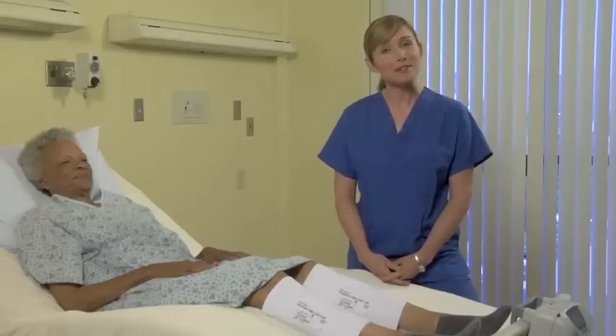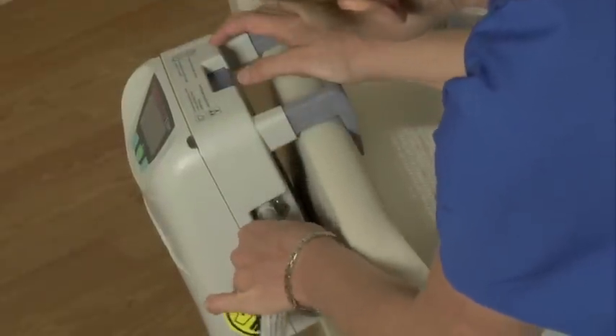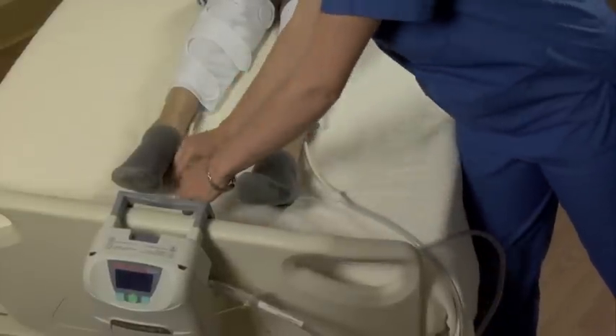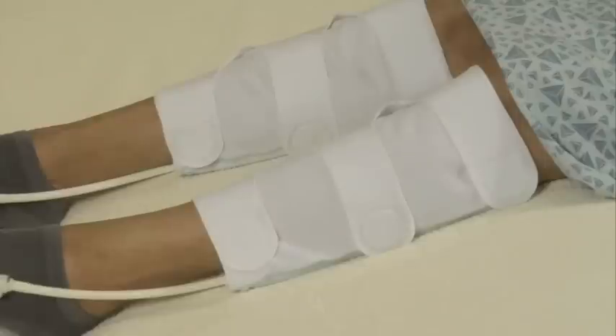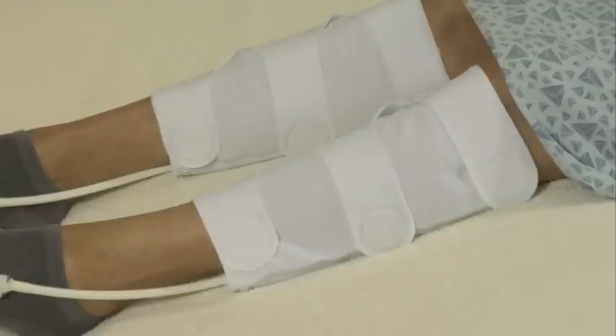The third step is to connect the system. Attach the tube assembly to the pump on one end and to the cuffs on the other. Make sure the connectors click securely together. Then press the green on/off button to power on the device. The cuffs will fill instantly, inflating the distal air cell first, then the proximal air cell a fraction of a second later. After six seconds, the cuffs deflate.